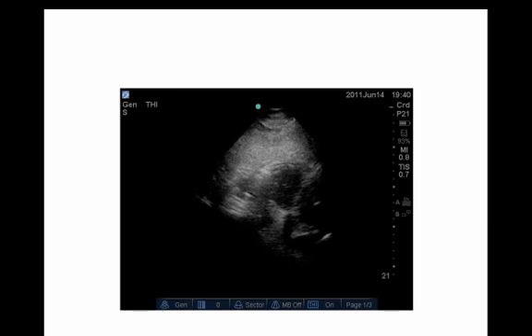This has prognostic significance as the image in the cardiac arrest scenario indicates a dismal prognosis. Remember, the objective of our exam is essentially binary, beating or not beating. We are not interested in gradations of LV function or regional wall motion. These evaluations require more advanced training and will be covered in future modules.